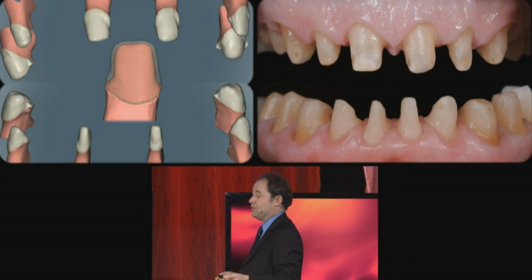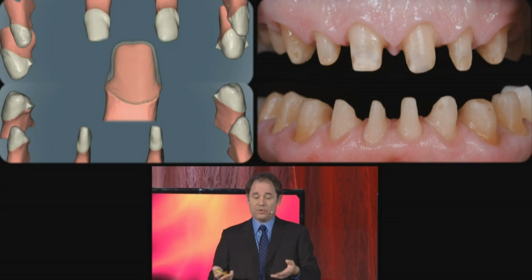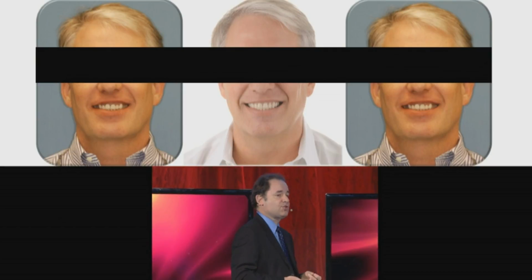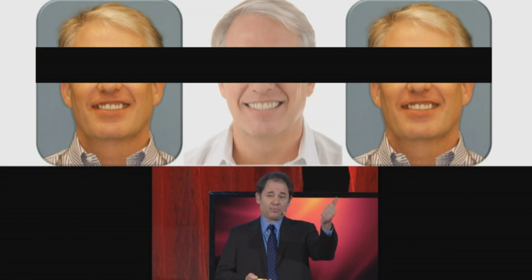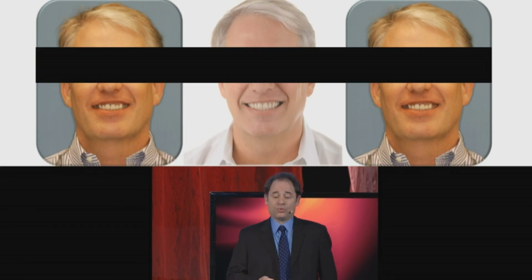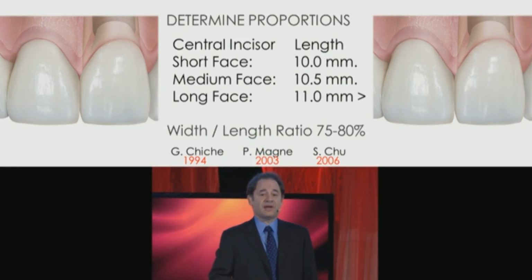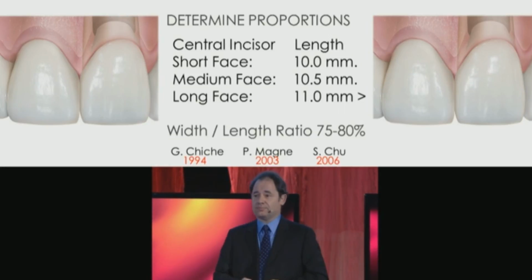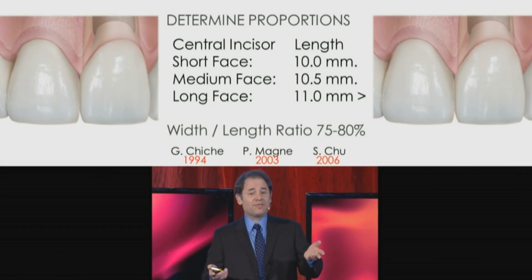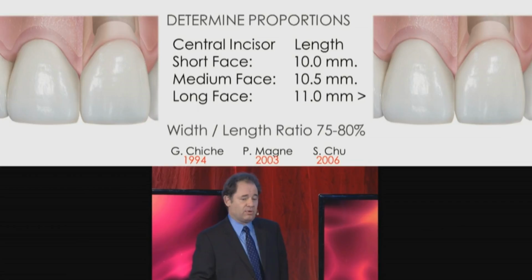So you have the preparations, we're going back in the treatment, and at some point we look at incisal edge position. Remember the sequence, but when you now look at the pre-op, and it comes to establish the central incisor length, we looked at upper lip, we look at lower lip. Now step number 3 is time to look at the face. And the system I would like to show you is very simple. The face will generate the general length of your central incisor. Tell yourself short face, 10 millimeters. Average face, 10.5 millimeters. Longer face, 11 and up. So the minimum is 10, but you can be flexible above 11.